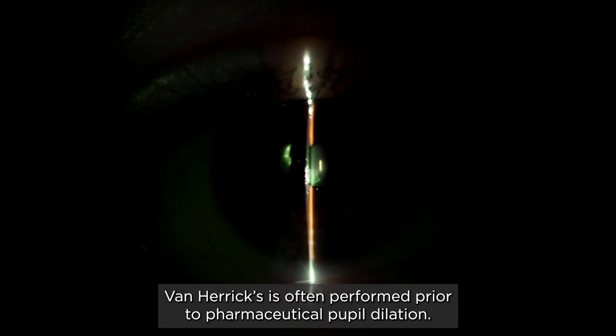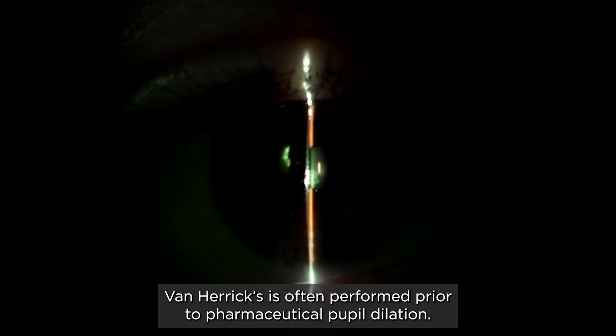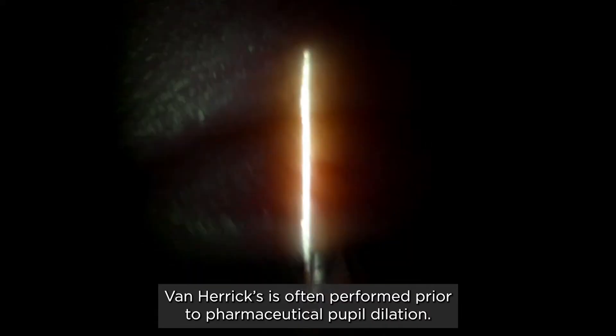The Van Herrick technique is a quick way of identifying people with narrow anterior chamber angles who need further investigation. Van Herrick's is often performed prior to pharmaceutical pupil dilation.